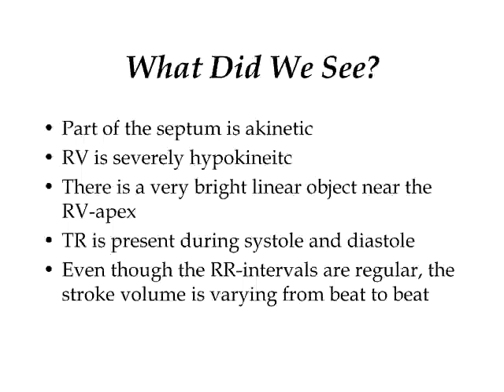Let's put this all together. Part of the septum is akinetic. The inferior wall is akinetic. The right ventricle is severely hypokinetic. There is a bright echo signal near the RV apex, and there is tricuspid regurgitation in both systole and diastole. Even though the R-R intervals are regular, the stroke volume — as demonstrated through the pulse-wave signal in the LVOT — is varying from beat to beat.